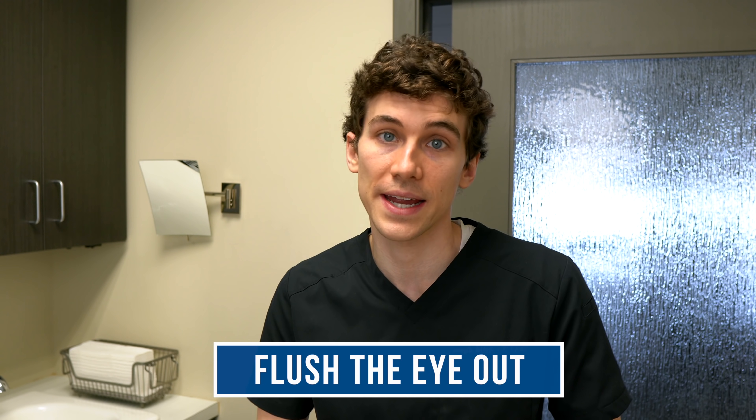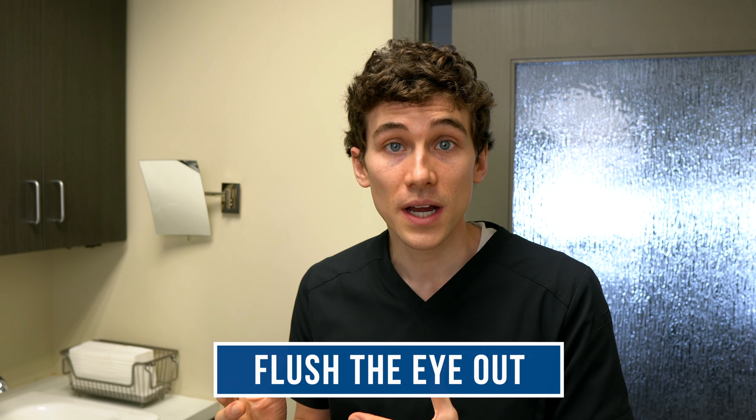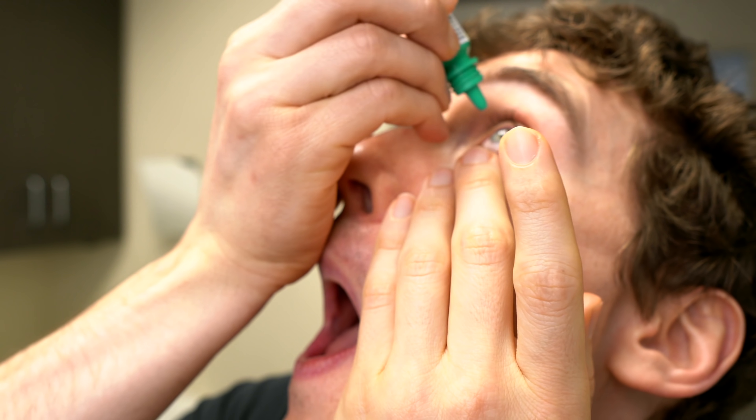If you're still having trouble getting the lens out, flush the eye. Use a sterile saline eyewash if you have one, or again the multi-purpose solution that is not the hydrogen peroxide red-cap bottle. Flushing gets fluid moving and can help push the lens toward the opening of the eye.